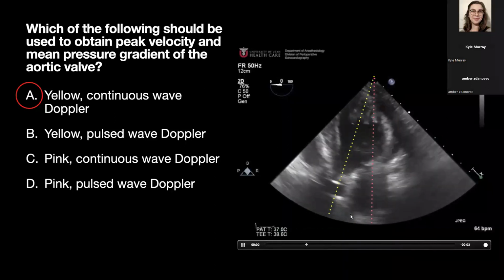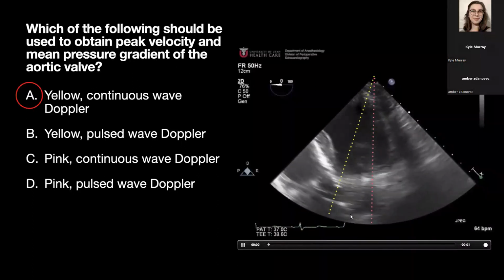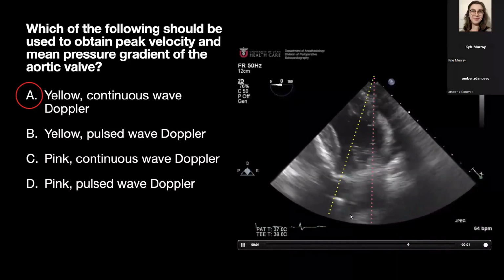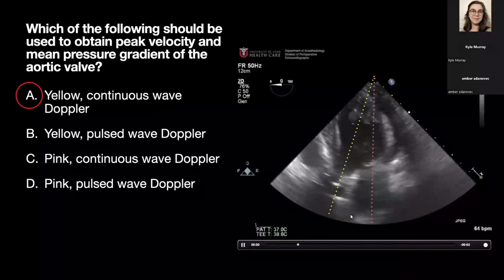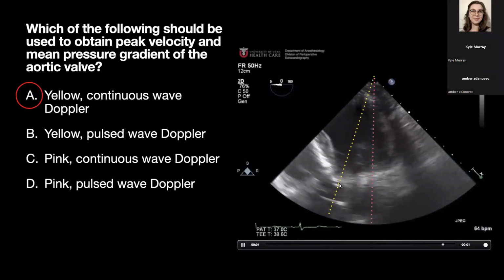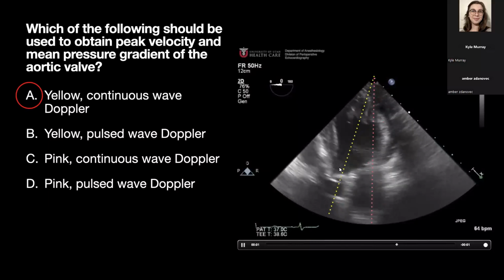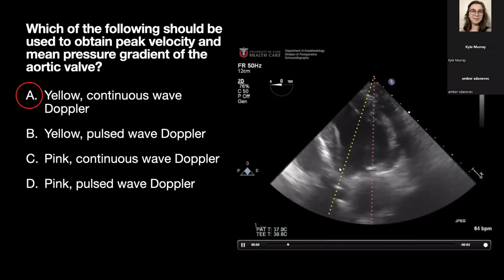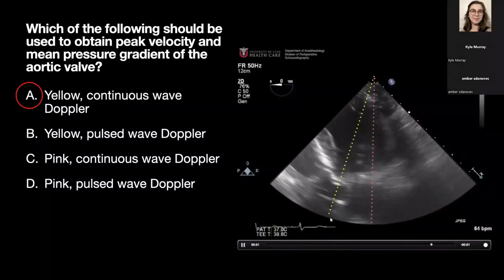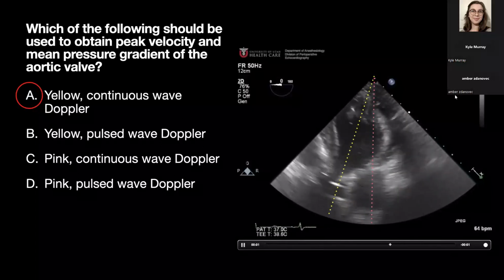This might be a weird question, but if you're doing continuous Doppler, will any tissue in the heart ever be moving faster than the blood flow? Do you have to worry about actually hitting the valve tissue itself? Nope. All you have to worry about is that usually it's your valve that's the stenotic thing. But if you have a subaortic membrane or stuff like that, that could be where your high stenosis is coming from. Because remember, with continuous wave, you're not pinpointing any specific point, which is why you interrogate it in 2D beforehand.